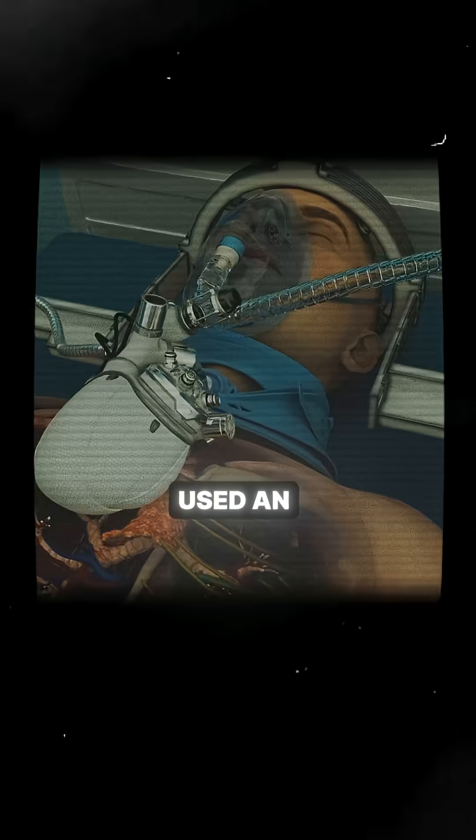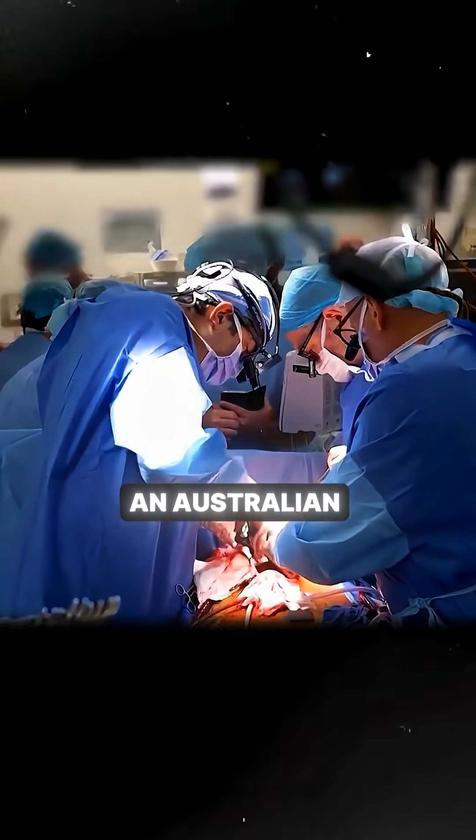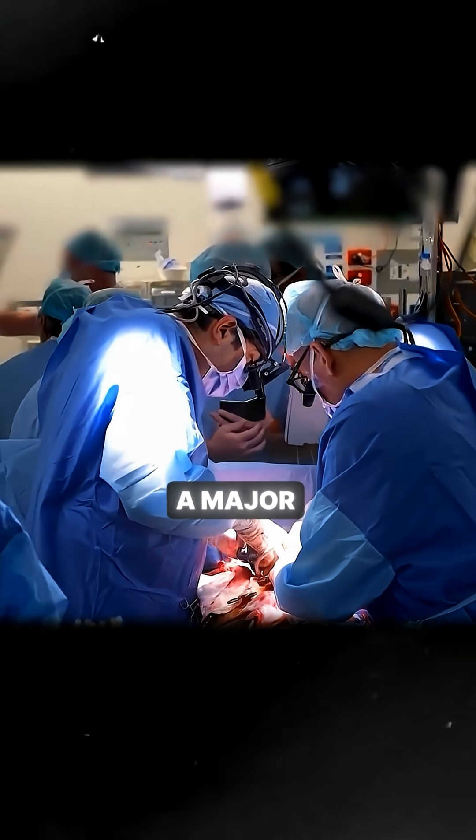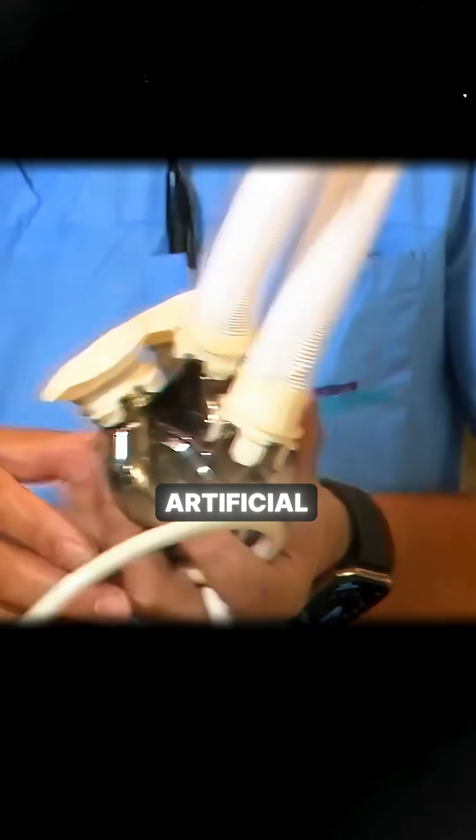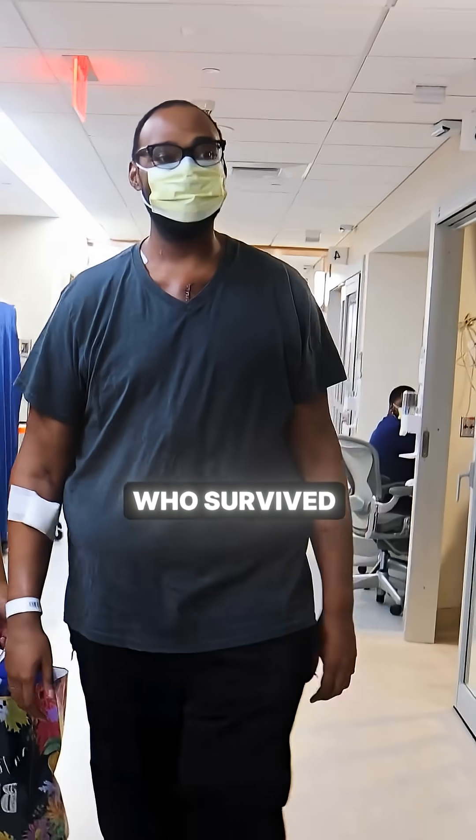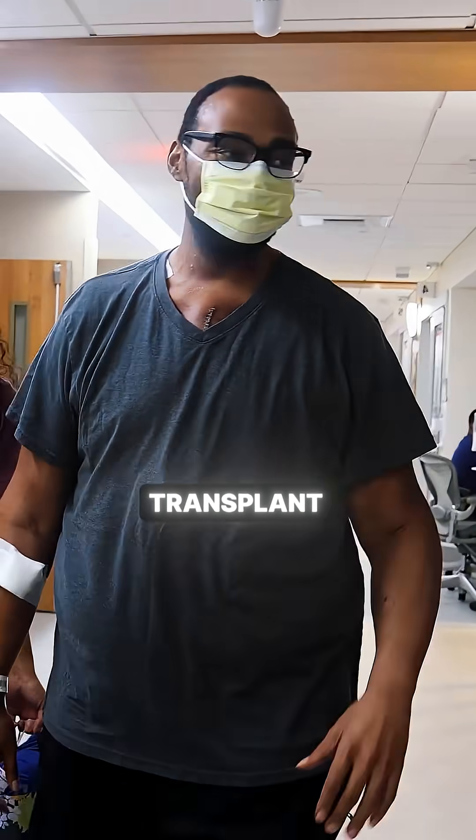Did you know that doctors have successfully used an artificial heart in a patient? An Australian medical team has achieved a major milestone in cardiac medicine, successfully implanting the world's first fully artificial heart in a patient who survived for 100 days while awaiting a donor transplant.